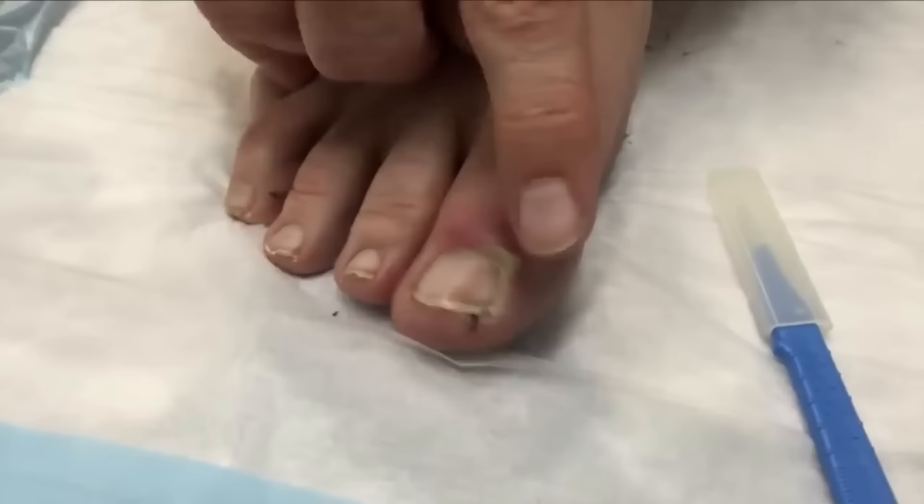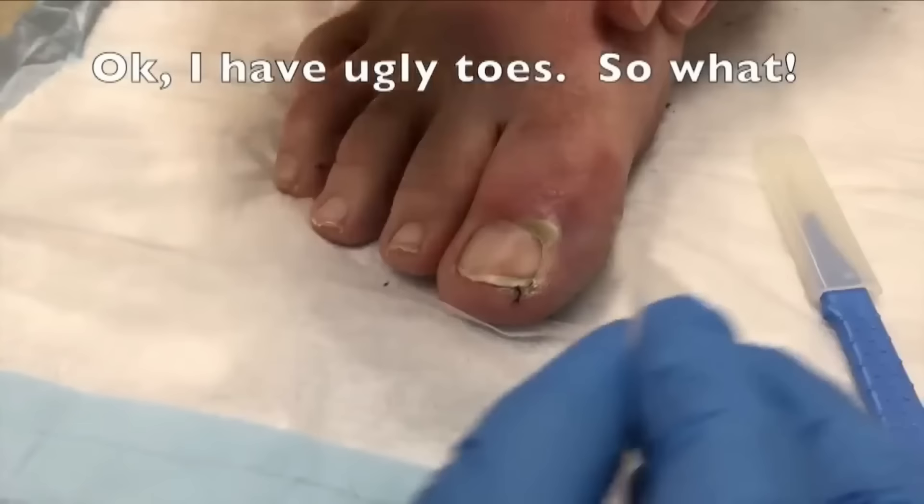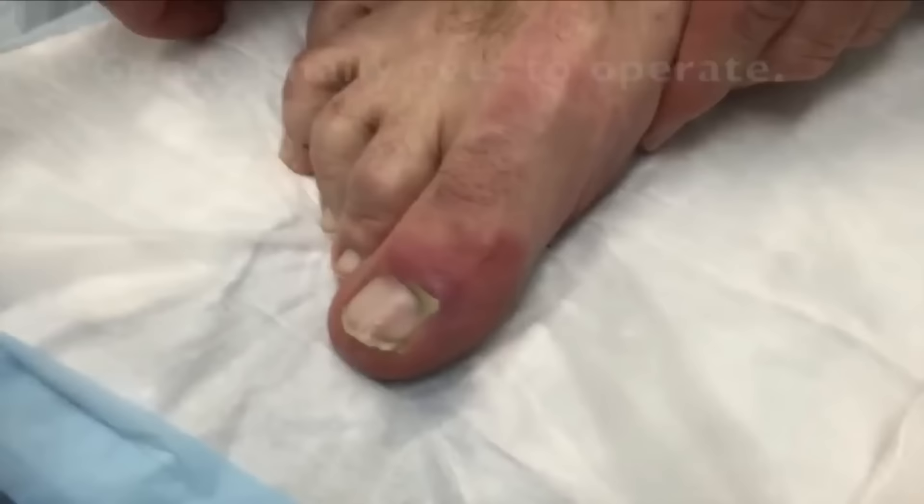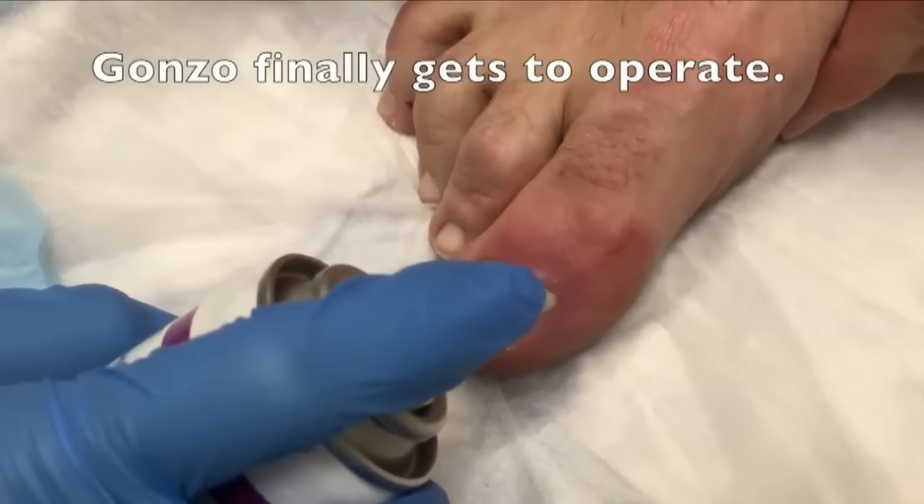You're going to clean this with alcohol, then spray it really good with cold spray. You're going to take the scalpel and just make a little stick right in that area there. Be careful, it's pretty sore. This little black thing is just fuzz from my sock. If I feel a lot of pain, I'll be screaming.